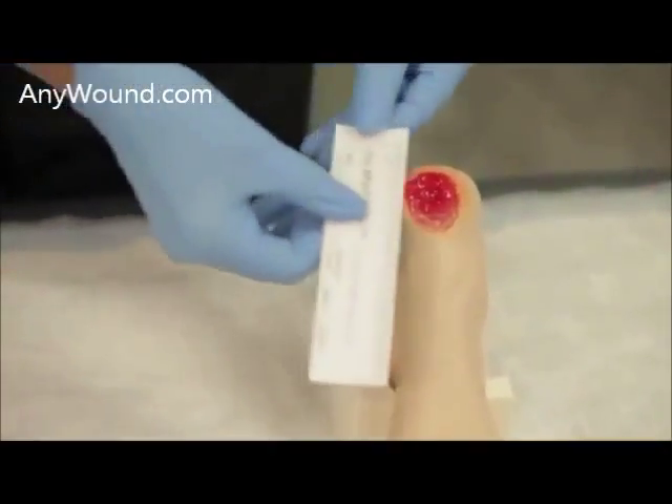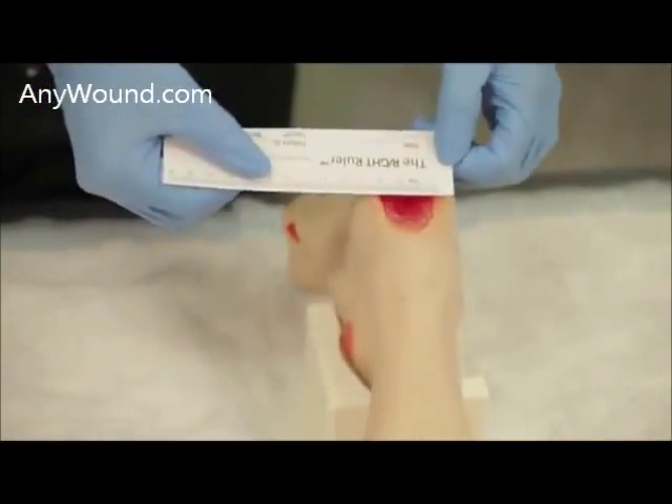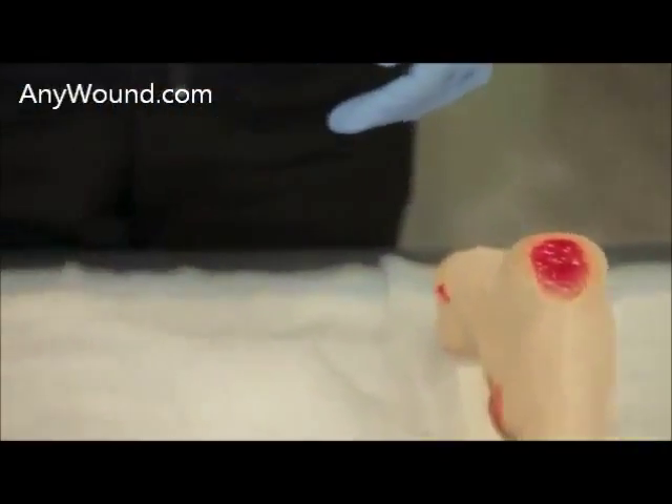The first thing you'll need to do is measure the size of the wound. This is a 3 cm by 3 cm wound.